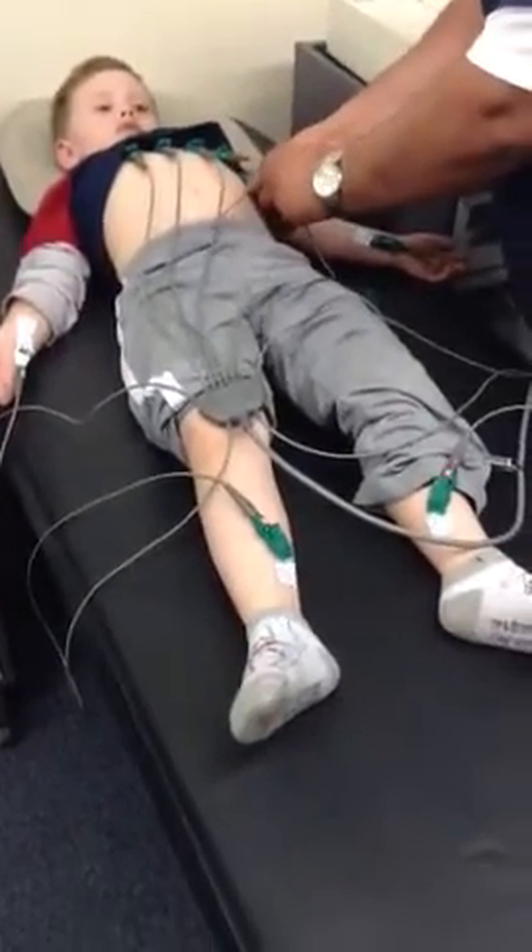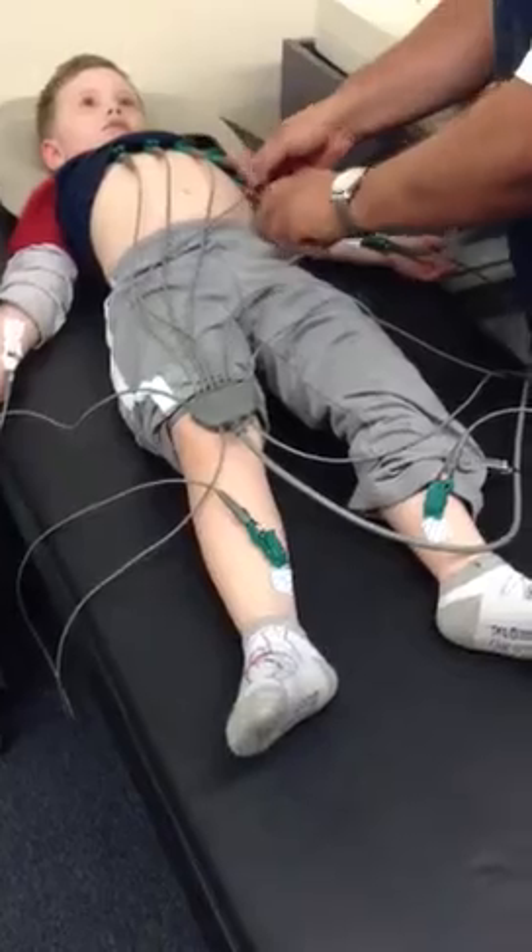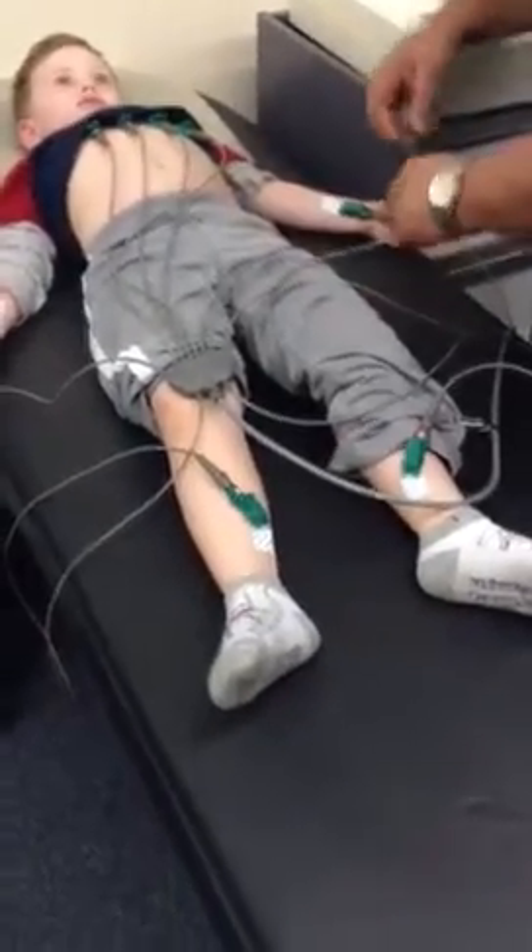And then V5. Clip V5. Make sure again that these clips are the right side up, not upside down. They don't work upside down — they only work right side up.